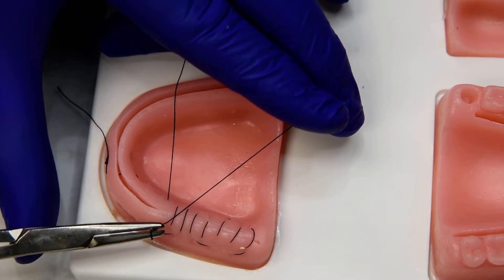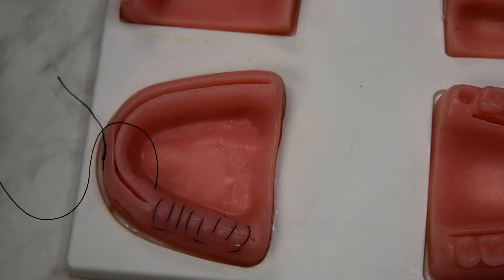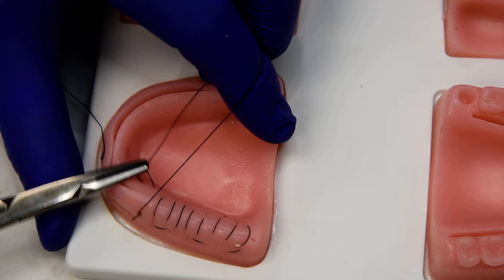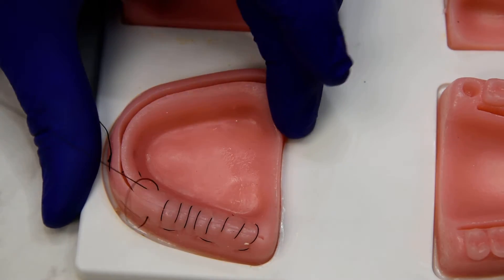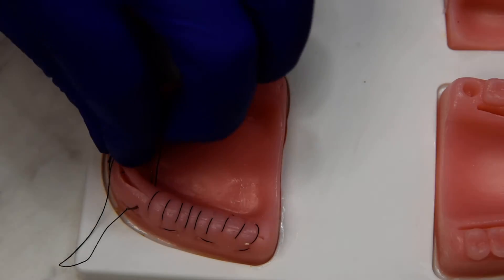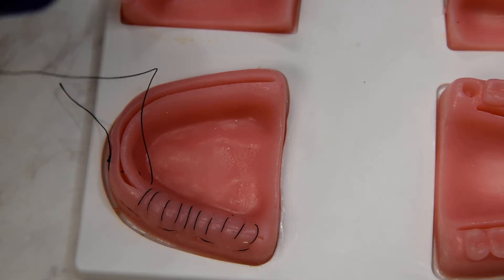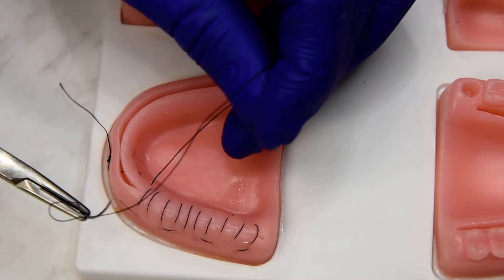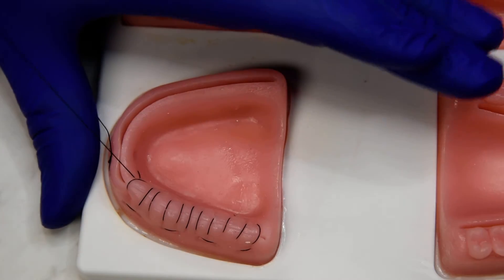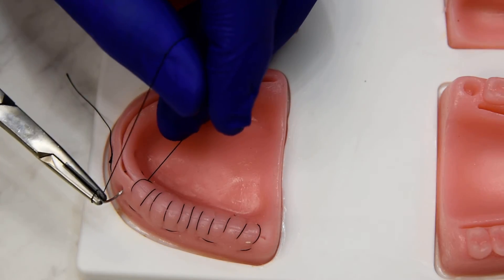This is a great suture for fixed full arch where there's multi-unit abutments or immediate load abutments, and you're trying to get the tissue cinched around them all for an immediate load provisional. We're just working even spacing all the way back to the midline. And at the end you can always go back if you see a space where the sutures are too far apart — you can add another simple interrupted or another mattress if needed.